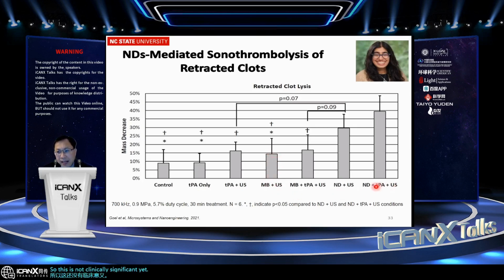And the good thing with this nanodroplet, we use tPA with ultrasound, will bring that up to about 40%. So this is very impressive. And this is also one of the very first papers where we demonstrate this effective retracted clot lysis.